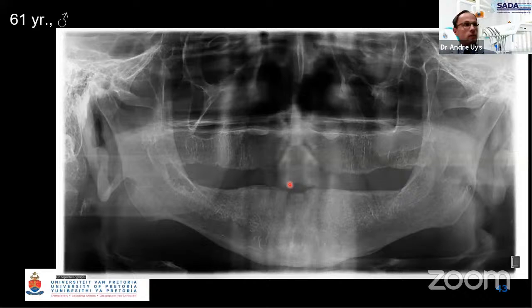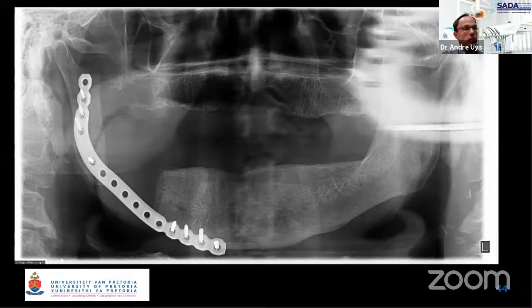Now, I'm going to use this pen just to demonstrate that clinical and medical history is very important, especially if you're going to report for another clinician. Now, I'm going to leave this, and you can view this. I'll give it away just now. I'm going to go to the next one. You'll see that this patient, it turned out like that.